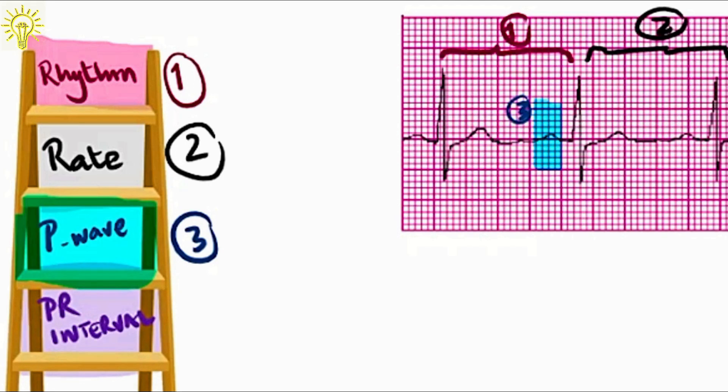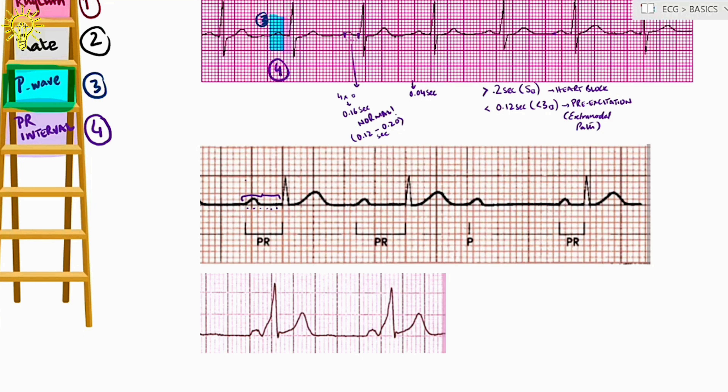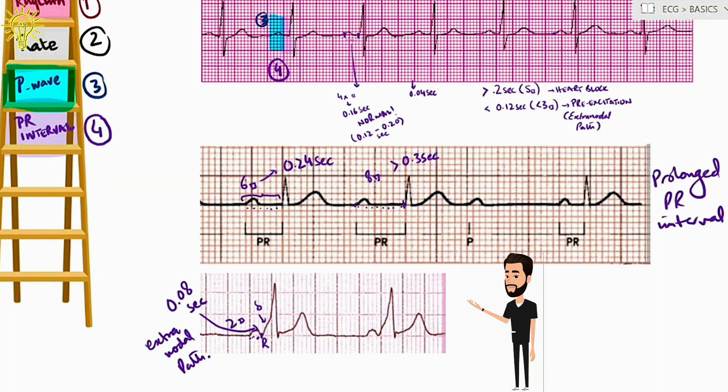Step 4: The PR interval. Normal PR interval is 0.12 seconds to 0.2 seconds. This makes three to five small boxes between start of P to the start of Q. Like here, it is four small boxes. So, 0.16 which is normal. In the second ECG, you can see six small boxes making PR interval. So, it is type of a heart block. In the last ECG, the PR interval is barely two small boxes. Hence, a shortened PR interval suggesting pre-excitation or as the term indicates, excitation of ventricle before normal time which can only happen if we remove the AV node delays. In other words, extra nodal pathway of impulse transmission.